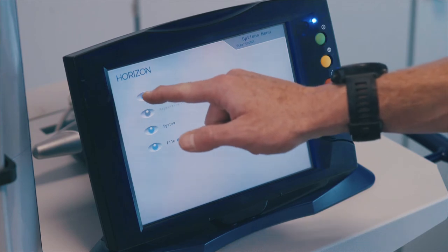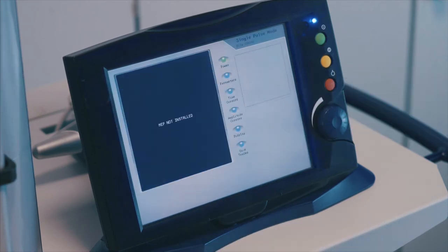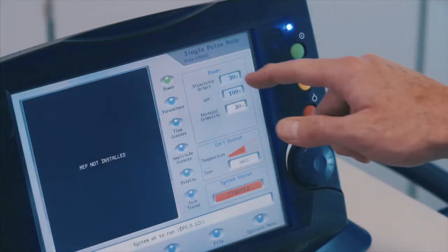From the main options menu, select single pulse. Select the power window and adjust to 50%.